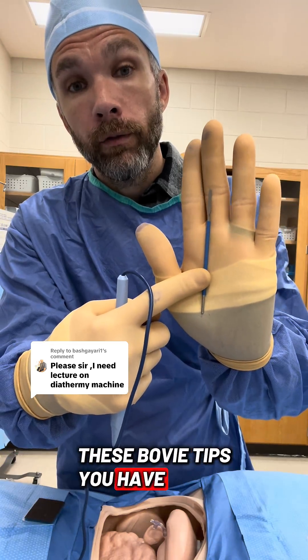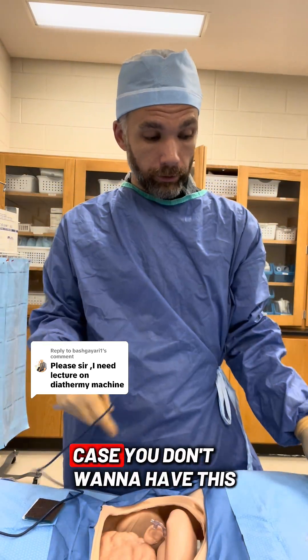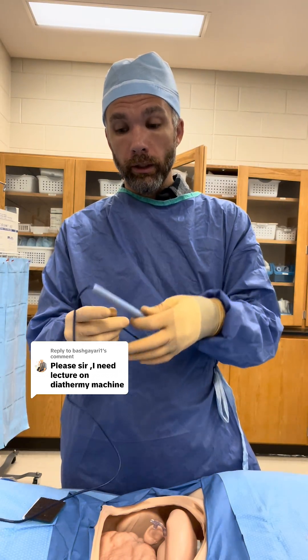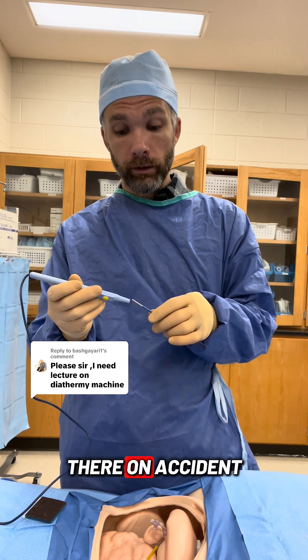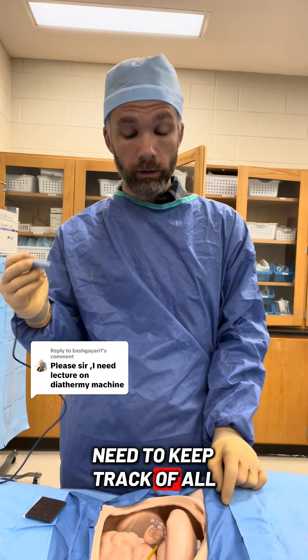Count all of your Bovie tips on an open case. You don't want to have a Bovie tip that you need to change, change it, and accidentally drop it down in there and not know where it is. You need to keep track of all of them.